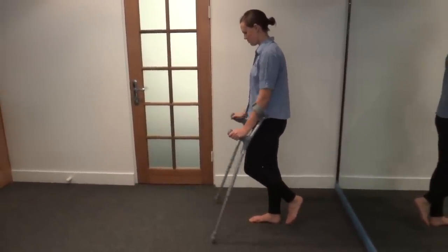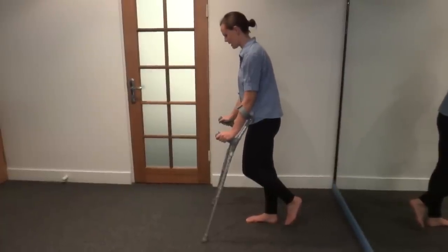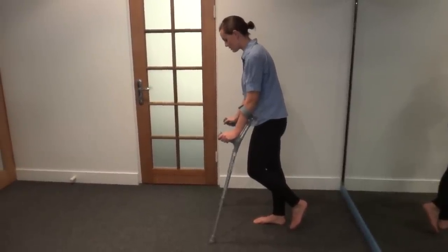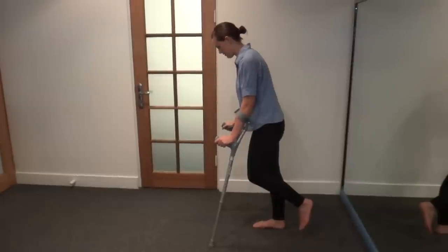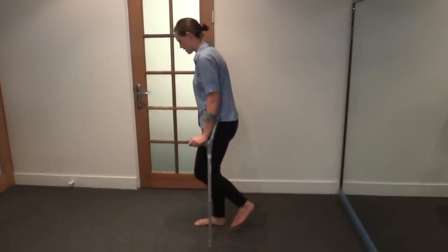What you're going to do is step your crutches forward just a nice short distance, making sure they're wider than your body so you have enough room to hop through. Place your hands down through your crutches, keep your non-weight bearing foot off the ground — not even touching — and then hop to the line of the crutch.